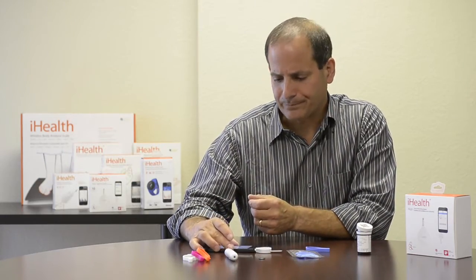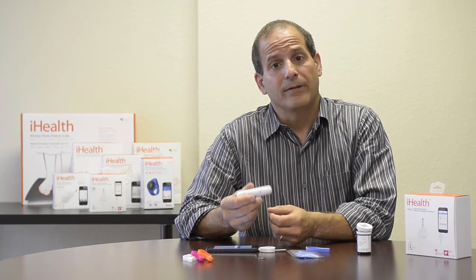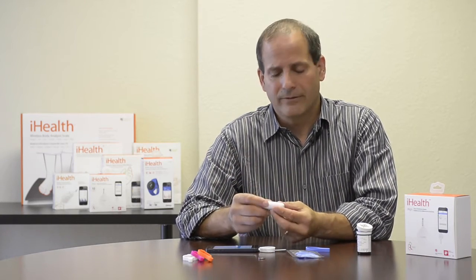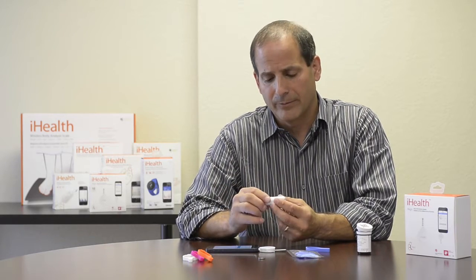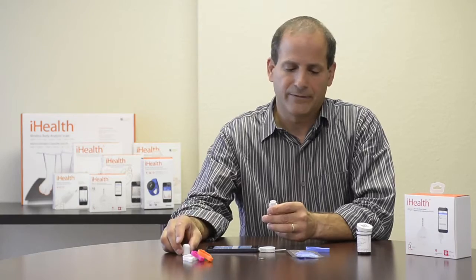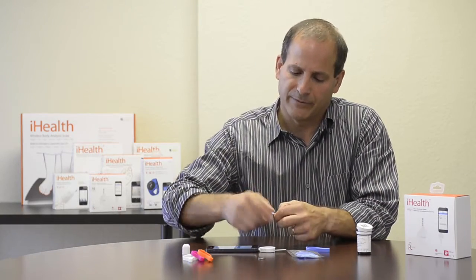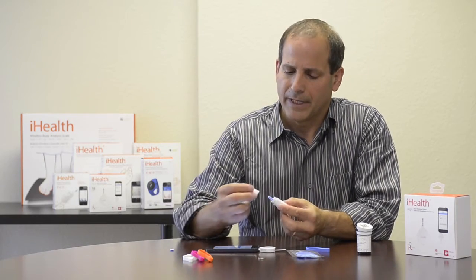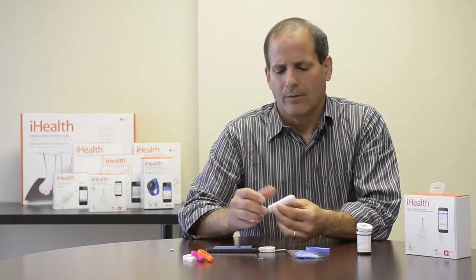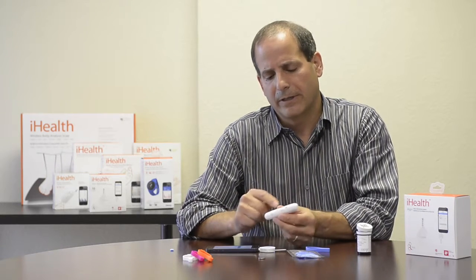Now it's time to draw some blood. The kit comes with a lancing device, which is very simple to use. It lets you adjust the depth and pressure from one to five — one being the lightest, five being the deepest. I'll set this to three by twisting the top until the three shows in the window. Then I pull off the top, insert a lancet, push it down firmly, twist off the protective top to expose the needle, and replace the cap. Once the needle is inserted, I load the device by twisting the bottom — you'll hear it click and see the button eject out.